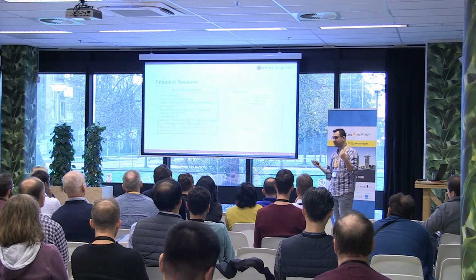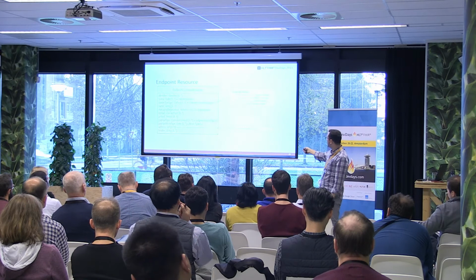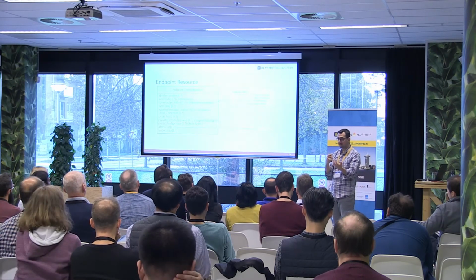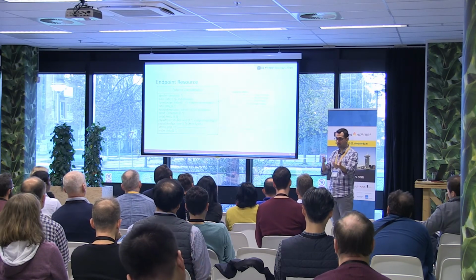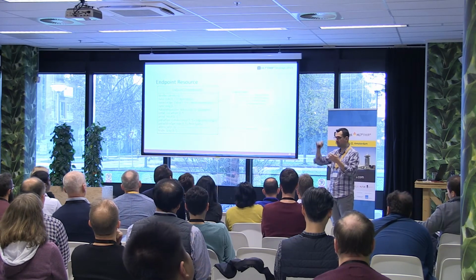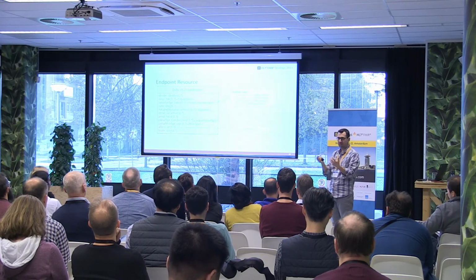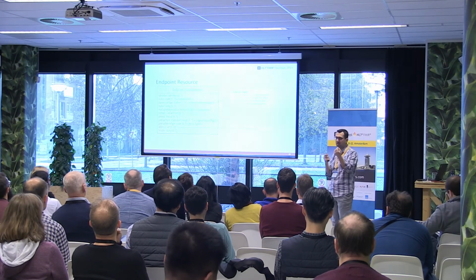So again, think of a study. If it's a study that's 100 megabytes in size, if you do any of these retrieves, then you're expecting to get 100 megabytes worth of data back and be able to process through this. But if you only need a couple more things that maybe were not stored in the FHIR object, then you want to do the query. You're just saying, give me more attributes. I need just a little bit more information.